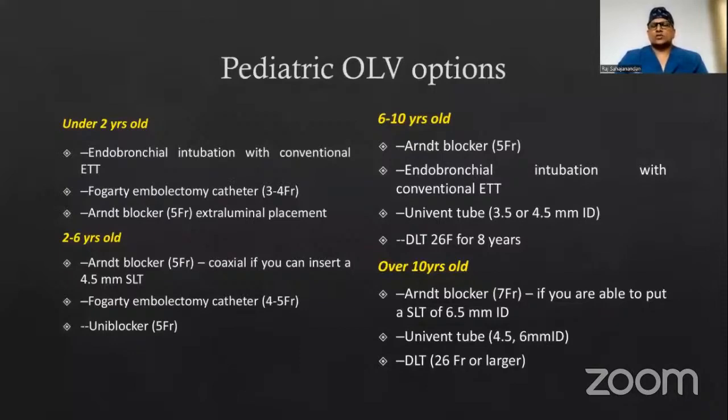So you leave that endotracheal tube on the Fogarty and fix it. You ask your assistant to fix it to the side of the face, do another laryngoscopy and use a one size smaller cuffed endotracheal tube so that the Fogarty can be kept in position. So that is what we used to do.